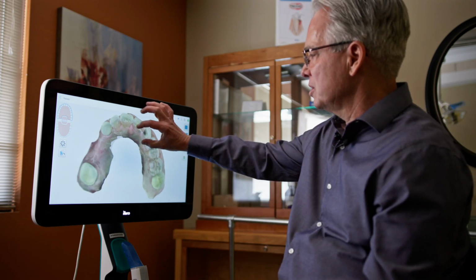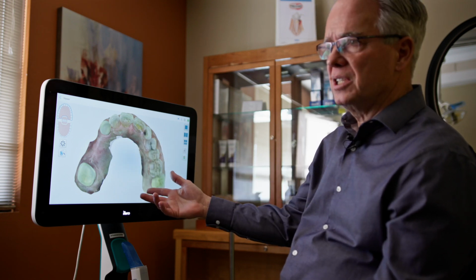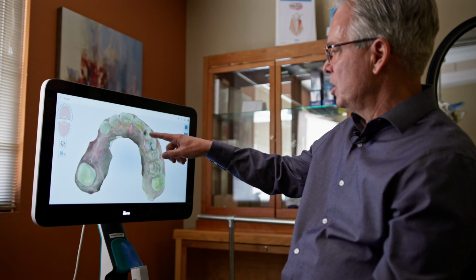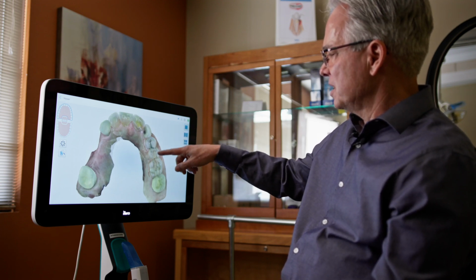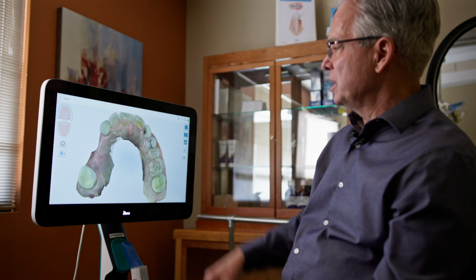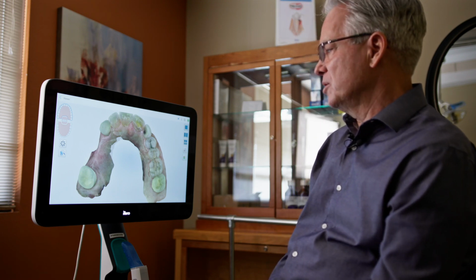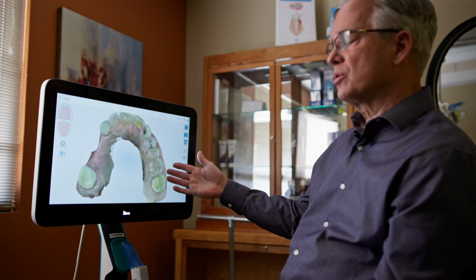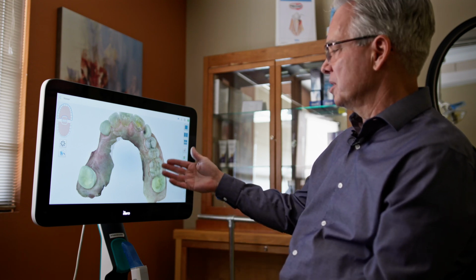And this is a good example of a lot of different things. The patient has had a few crowns on the teeth, is missing some teeth, and over here we see some old fillings. When the dentist sees things like this in the mouth that have been in there for a number of years, and they're not as healthy as they could be, I could tell the patient, you know what, I think this tooth or all these teeth need some treatment, and my recommendations are a filling or a crown or something.